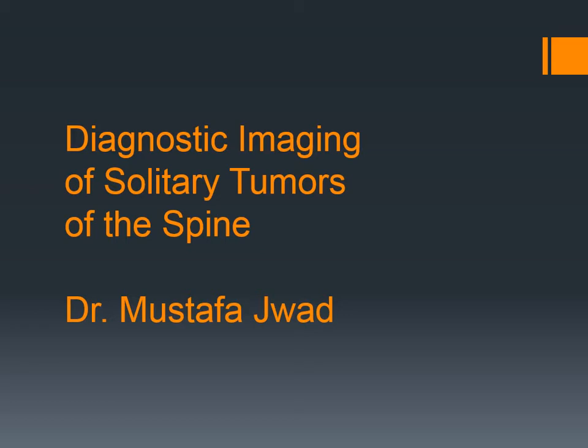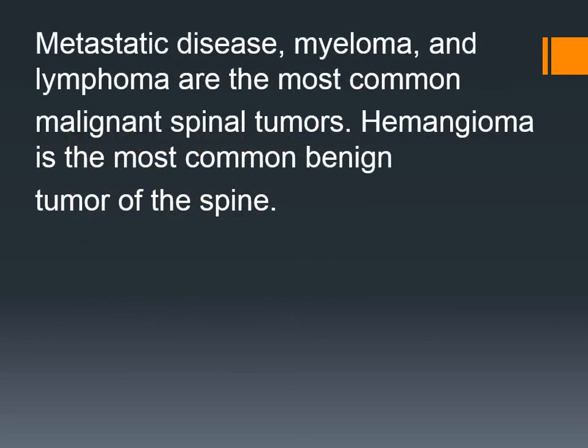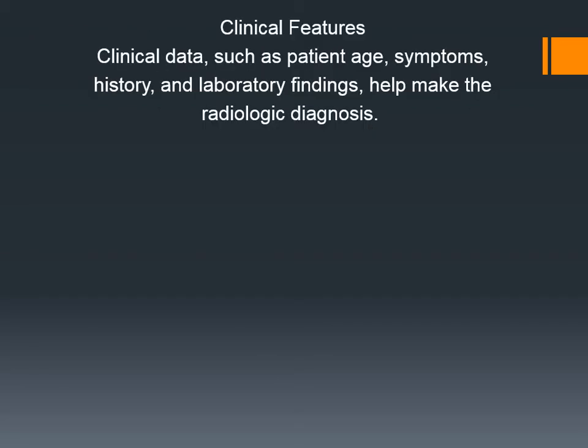Diagnostic imaging of solitary tumors of the spine. Metastatic disease, myeloma, and lymphoma are the most common malignant spinal tumors. Hemangioma is the most common benign tumor of the spine. Clinical data, such as patient's age, symptoms, history, and laboratory findings, help make the radiologic diagnosis.